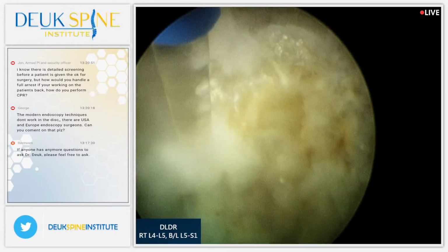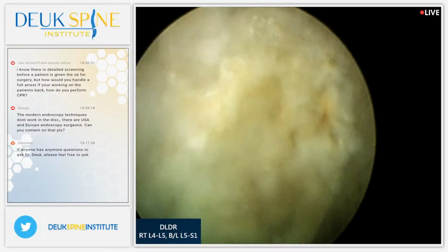Just about done. 5 minutes on this disc, Dr. Berndes.